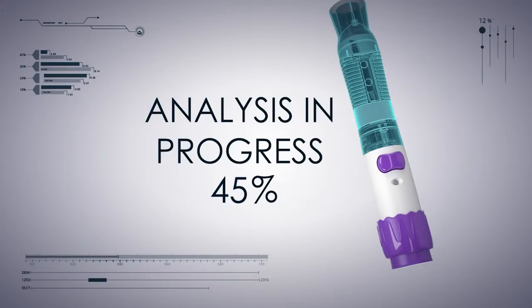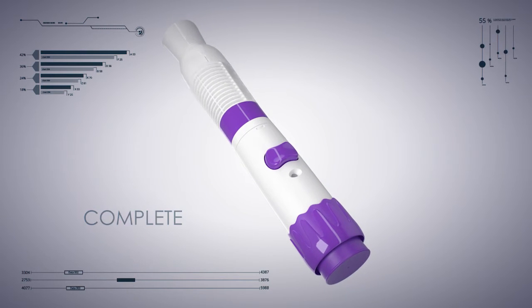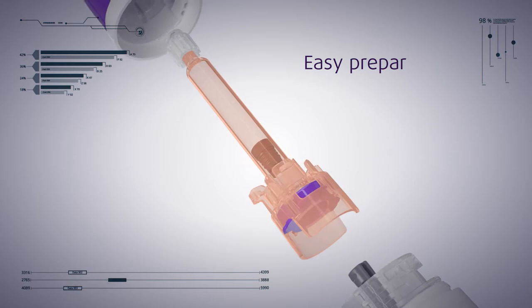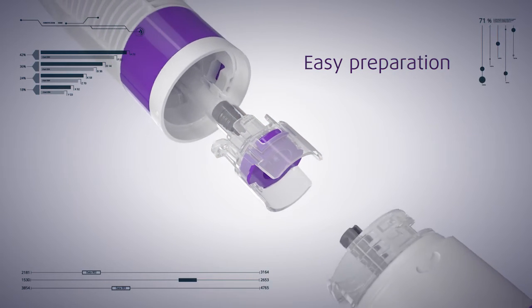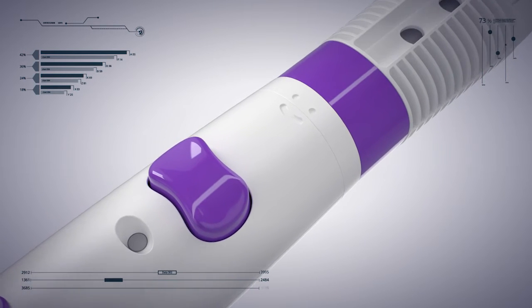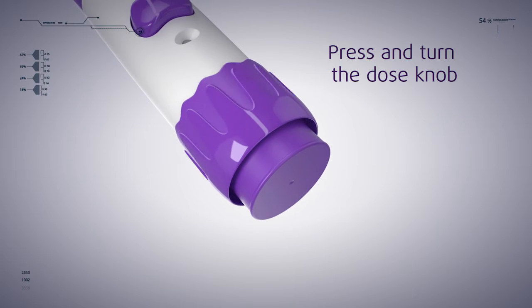Let's have a look at some of the details. This design is perfect to facilitate usage and easy preparation. The ADI is so simple to use. First, you insert the syringe. Then you twist both parts to align the eyes with the mouth. When the ADI smiles at you, you press and turn the dose knob. You're good to go.